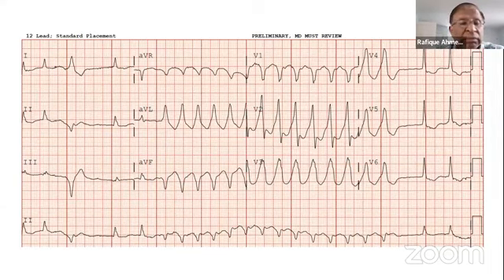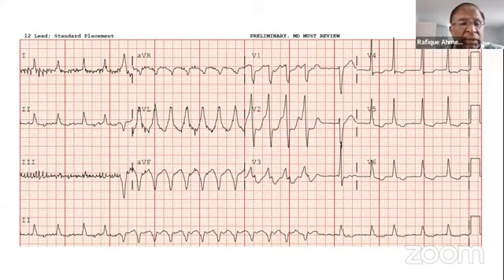Hafiz, can you go back to the first ECG, please? Yeah. So, first of all, for the audience, we need to determine what is the baseline. It's very difficult to determine from the beginning of the recording, but if you look at the end of the recording, in lead two, it's very irregular. And there is no P wave, so it's atrial fibrillation. After the fourth beat, the QRS morphology changes, and there is a degree of irregularity. And one can always argue that this is atrial fibrillation with rate-related bundle branch block.